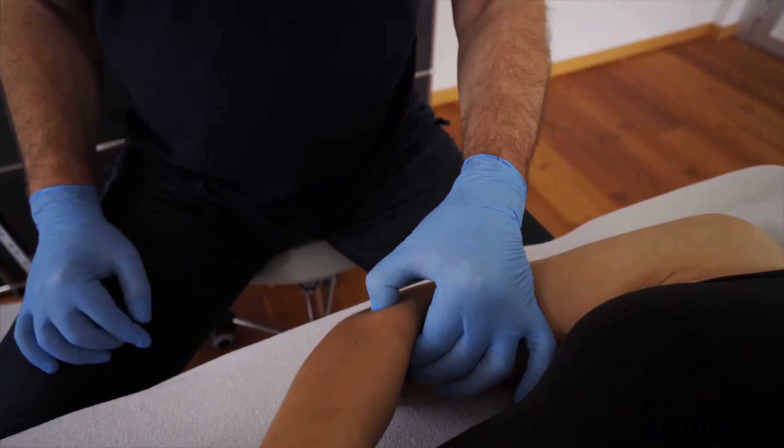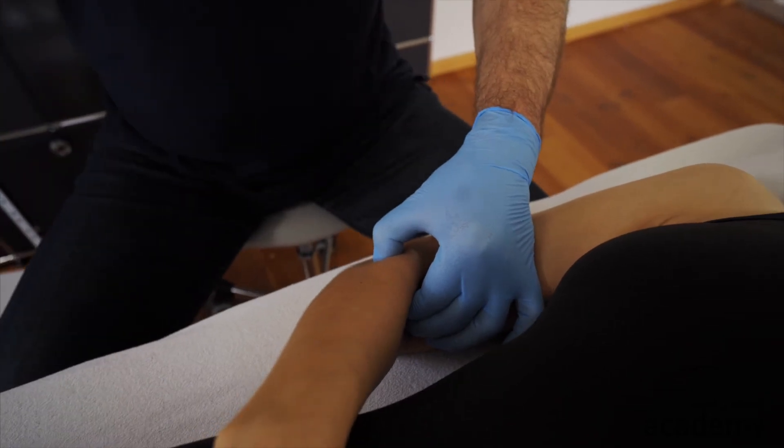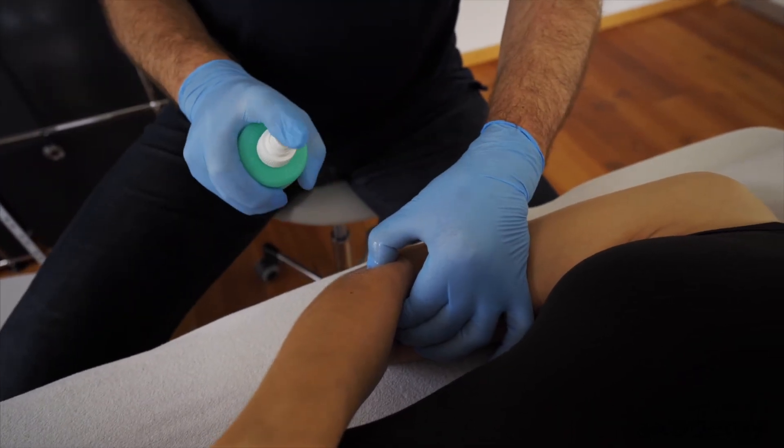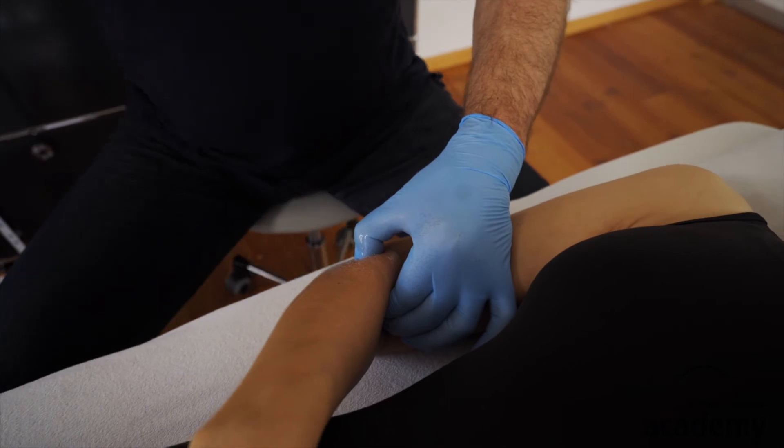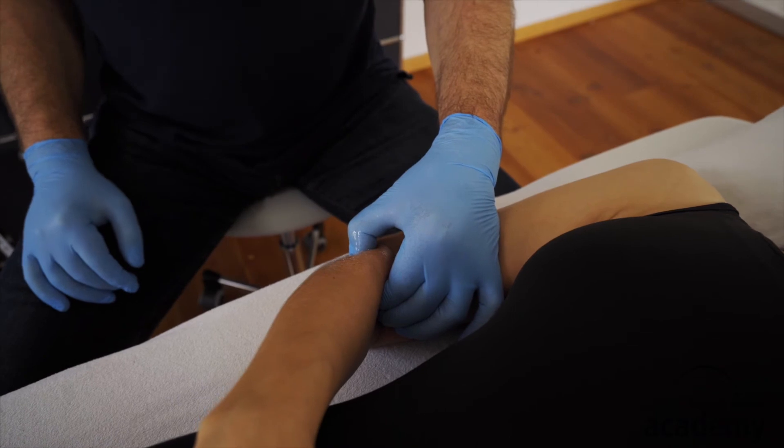Then palpate the taut band and the trigger point that you want to needle, and disinfect. Depending on the product, it takes 15 to 30 seconds.